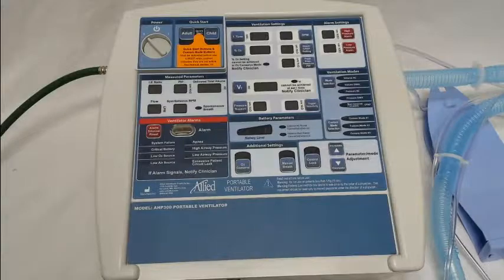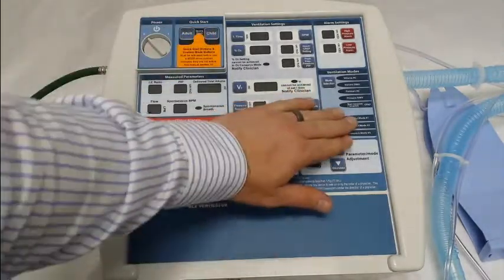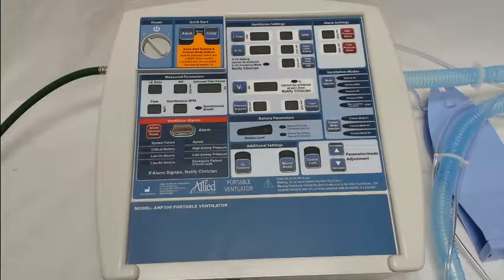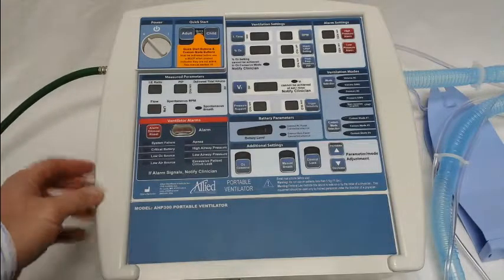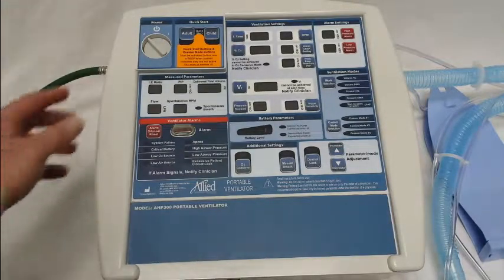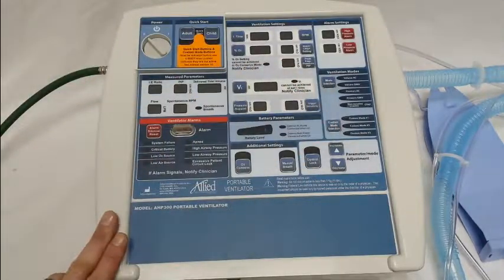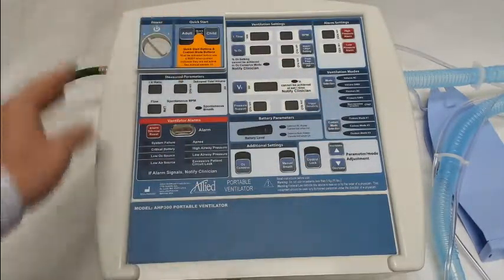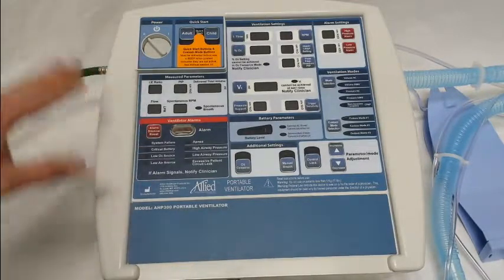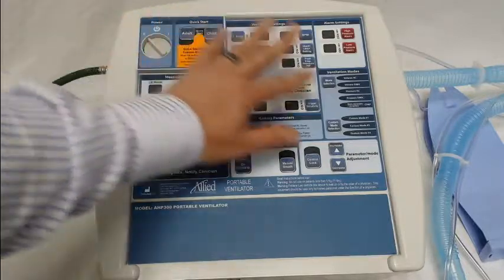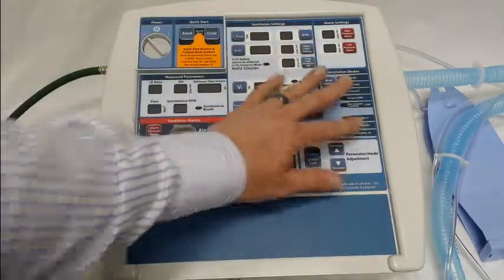This video will cover the initial programming of the adult and child quick start modes, as well as the initial programming of the custom modes on the AHP300 and the AHP300P transport ventilators from Allied Health Care Products. When these ventilators are shipped from the company, they come with the quick start and the custom modes locked out. That's because Allied Health Care Products feels it's important that the clinician or the institution set the parameters they want to use for adult, child, and custom modes.